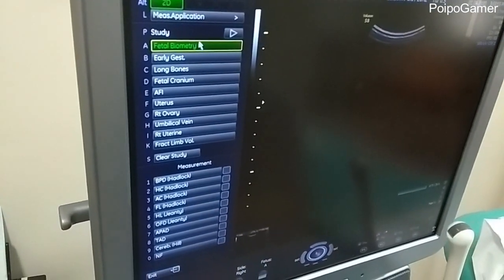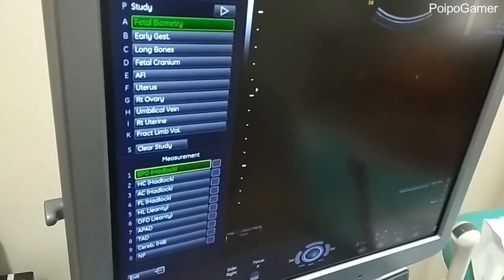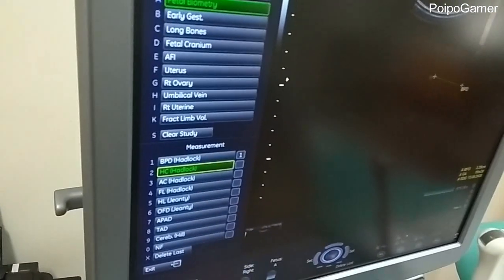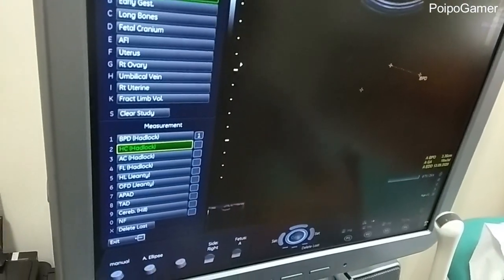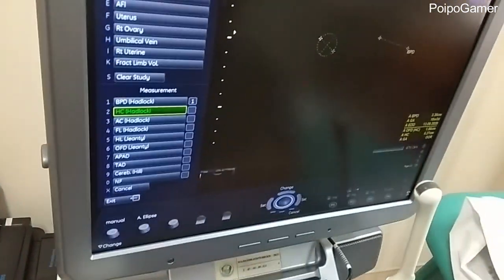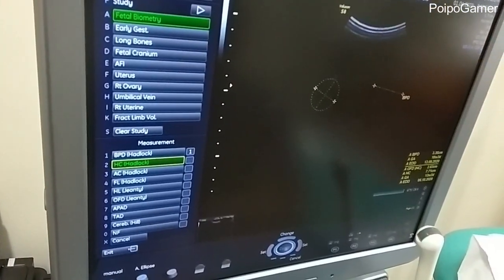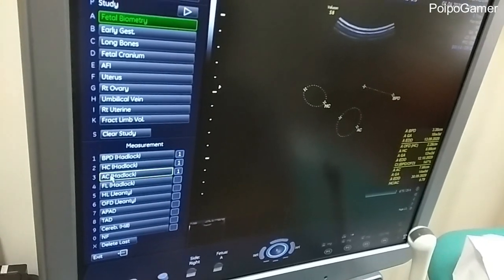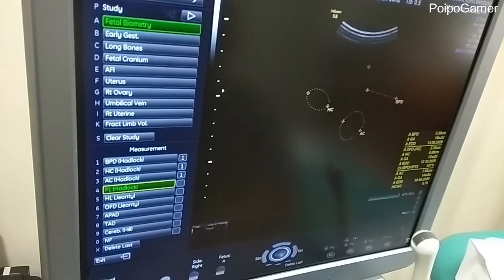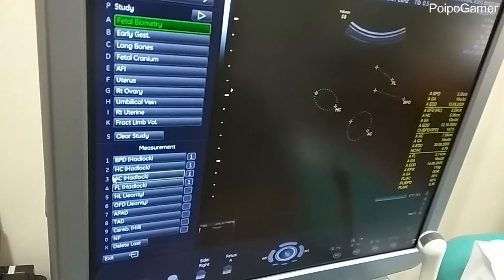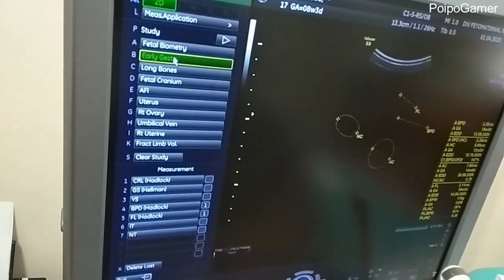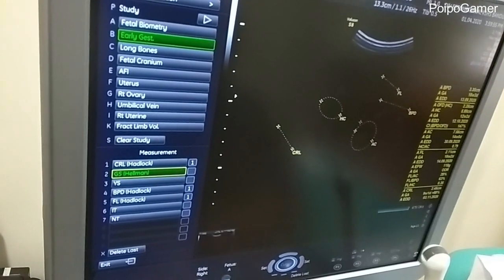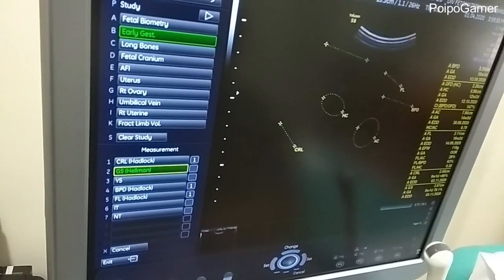No need to explain that. So we need to input BPD. This is first baby because it's fetus A. If you wanna switch to the second baby, we need to click this and it will be changed to second baby later. But you can do it later. FL also — the last one. I think this is it for fetal biometry. The next one is early gestational age — we just need to save two items here. This is random actually, so you might get confused, but I also get confused. And that's all.